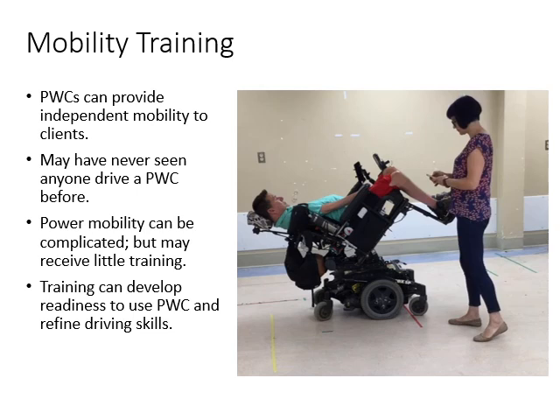Training is really, really important to help the client develop readiness to use a power wheelchair and to refine their driving skills. Of course, power wheelchairs are going to provide independent mobility to clients, but if a client hasn't learned to use all the capabilities of the chair, then we really aren't helping to maximize their potential.